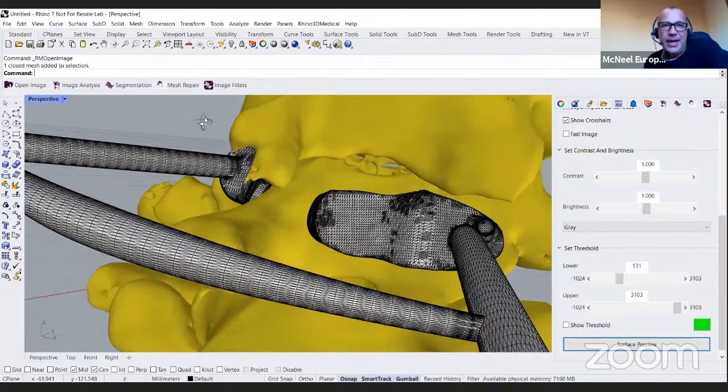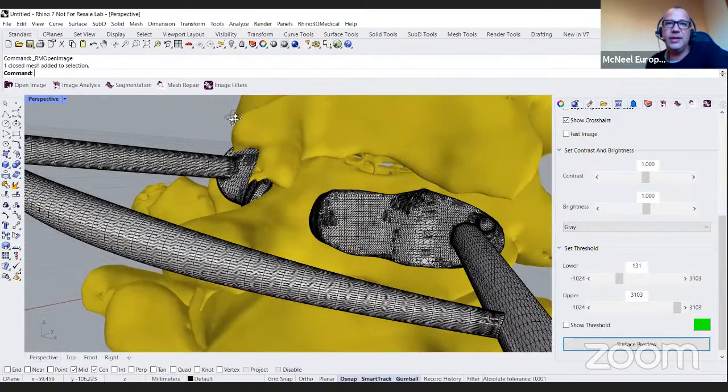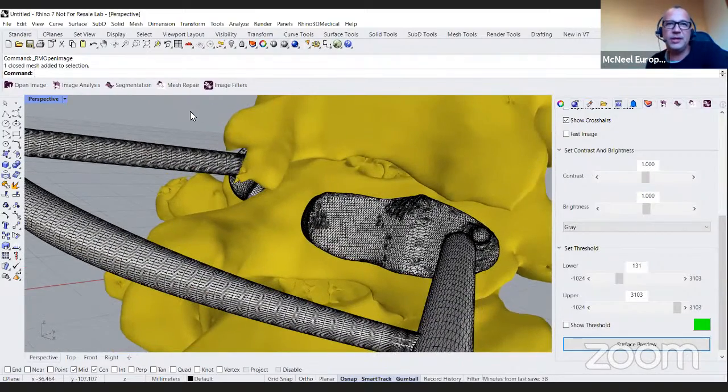There is one by the British Orthopedic Research Society, BORS 2020, I guess this is a nickname, and they're asking if you are able to extract section properties from the plane, for example, area, second moment of area, when you cut with a plane, if you are able to extract those properties.